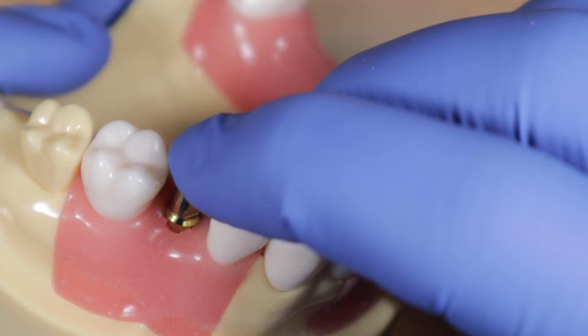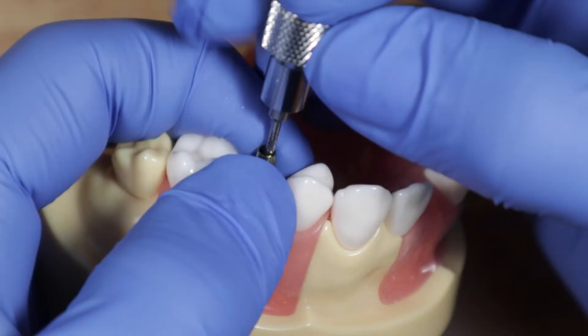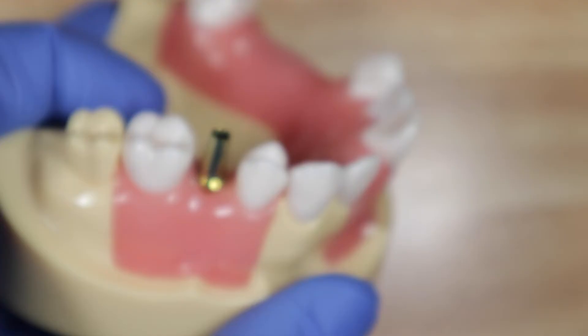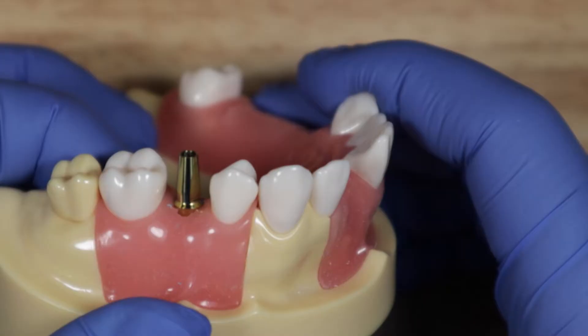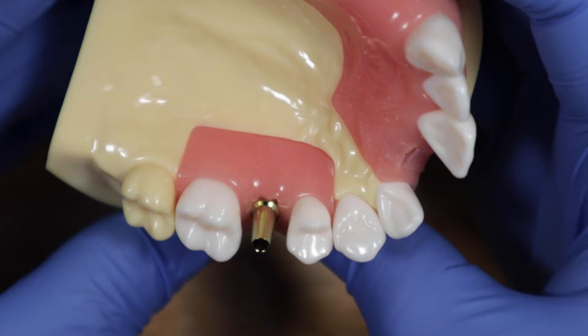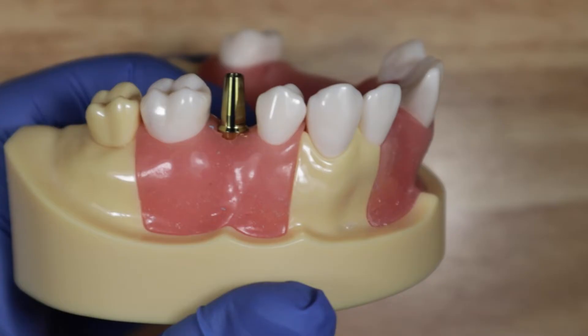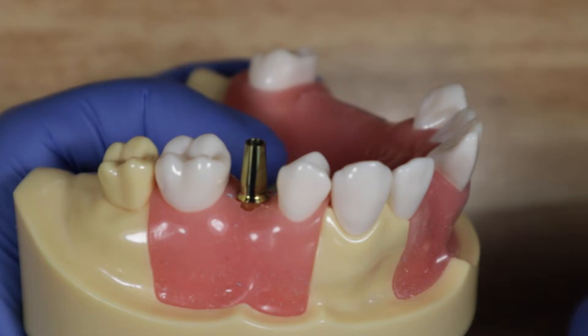Once you feel it go into the right engagement, hold it in place and tighten it down. I like to hold it with my other two fingers while tightening to make sure it doesn't shift. Now it's fully tightened. Take notice of where the flat end is — here it's on the mesial. Everything's seated. You can take a radiograph now to confirm full seating; with internal hex implants it's not 100% necessary, but it's always the safe approach.